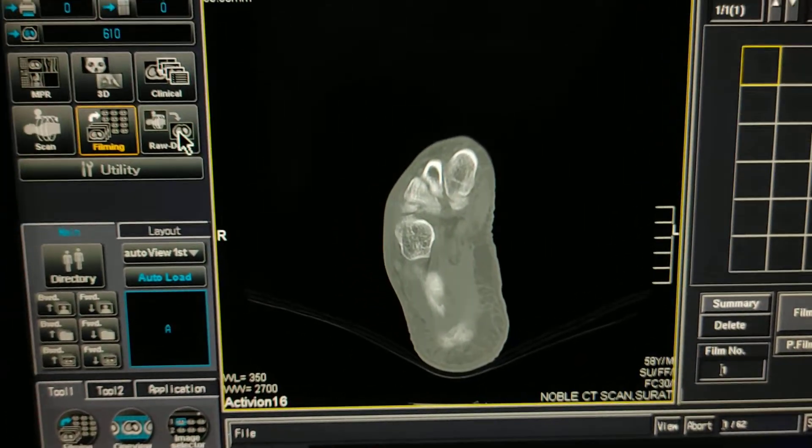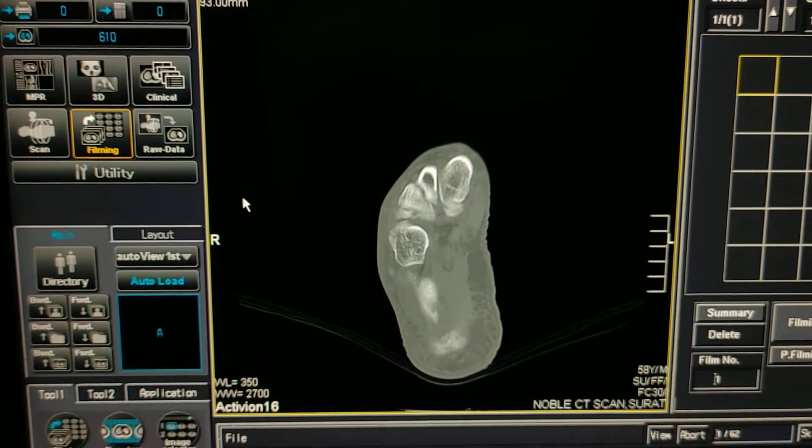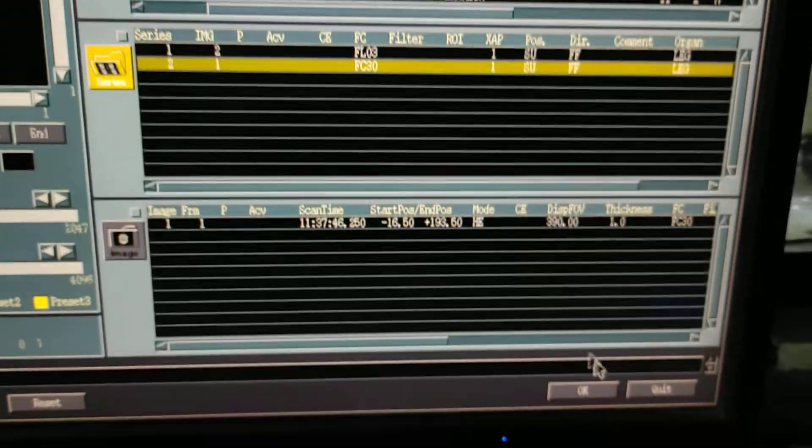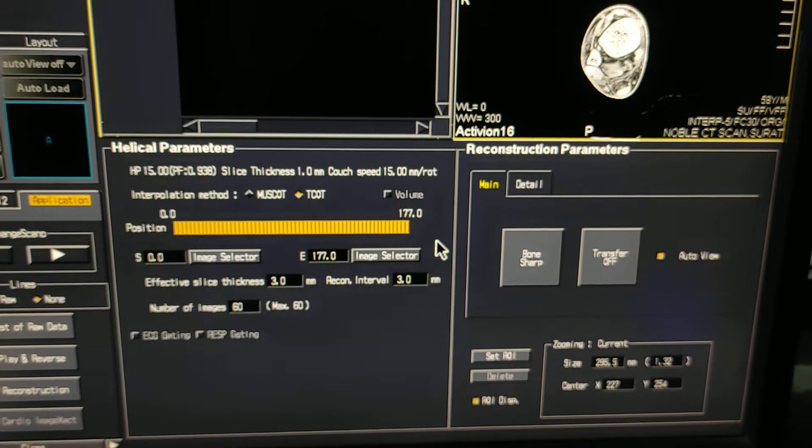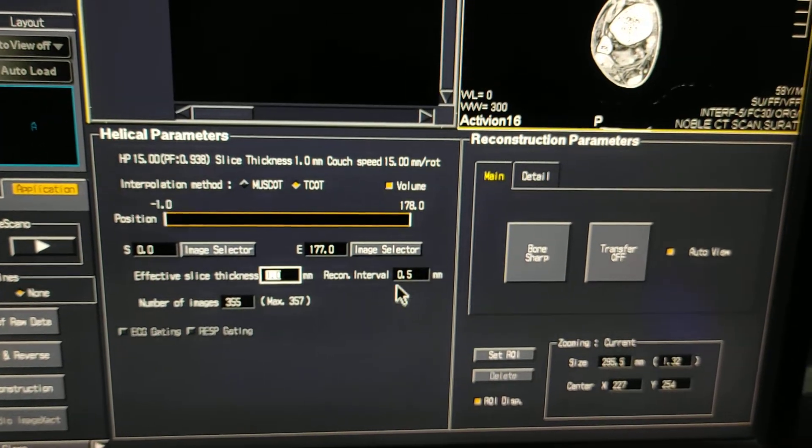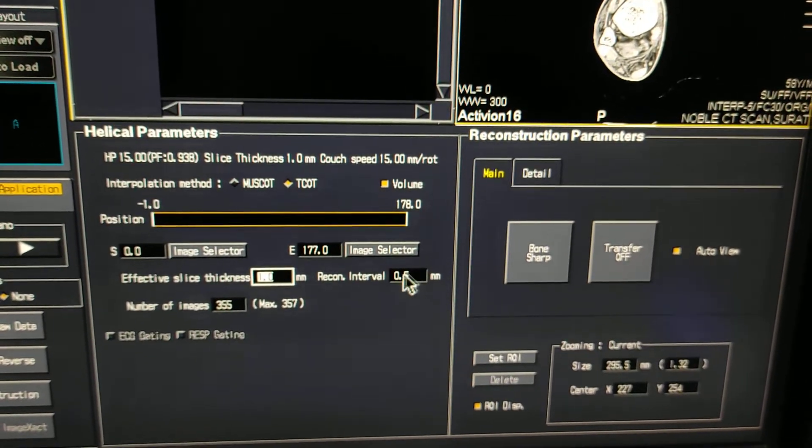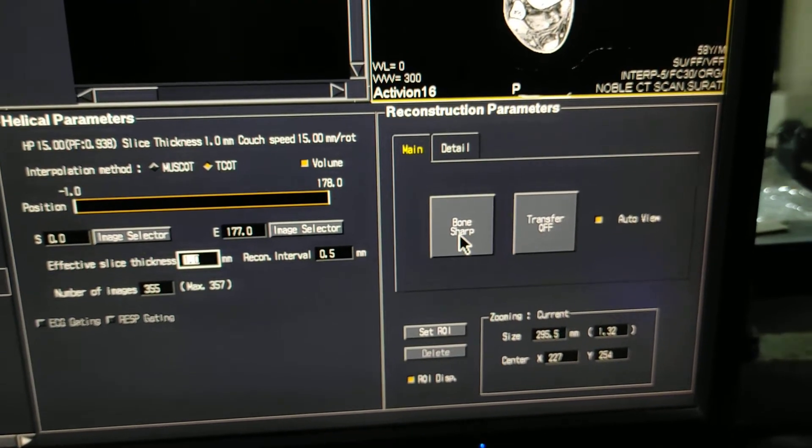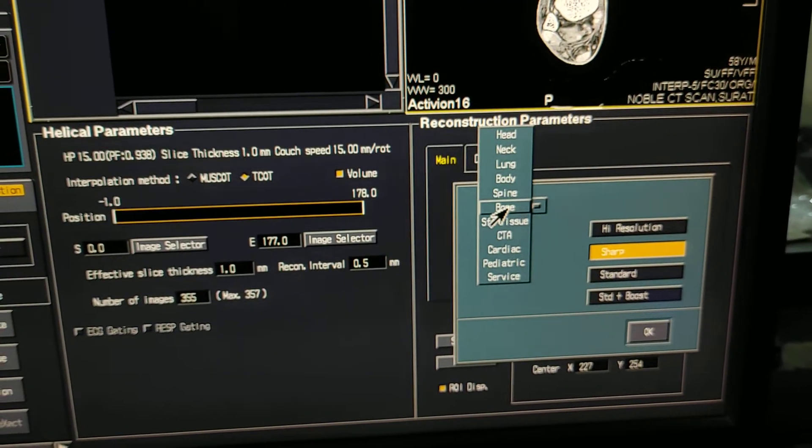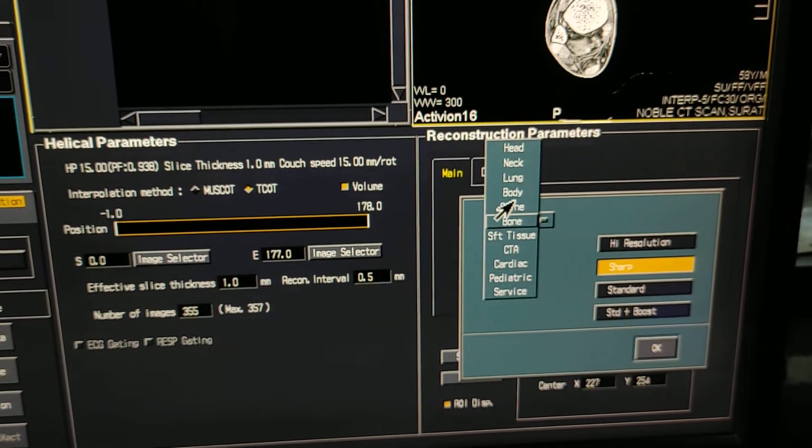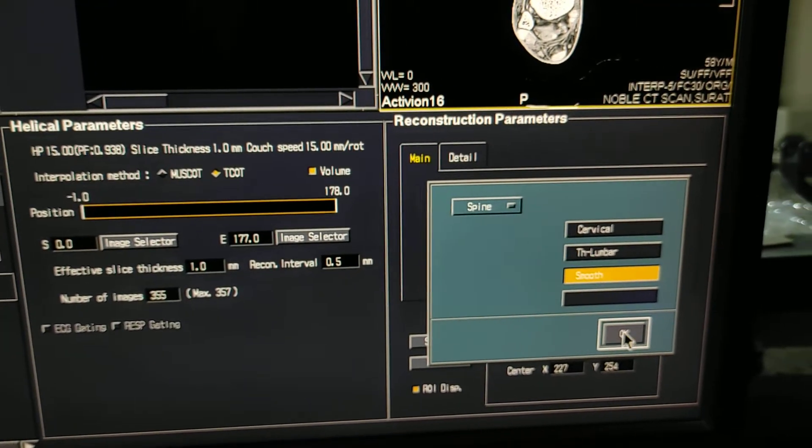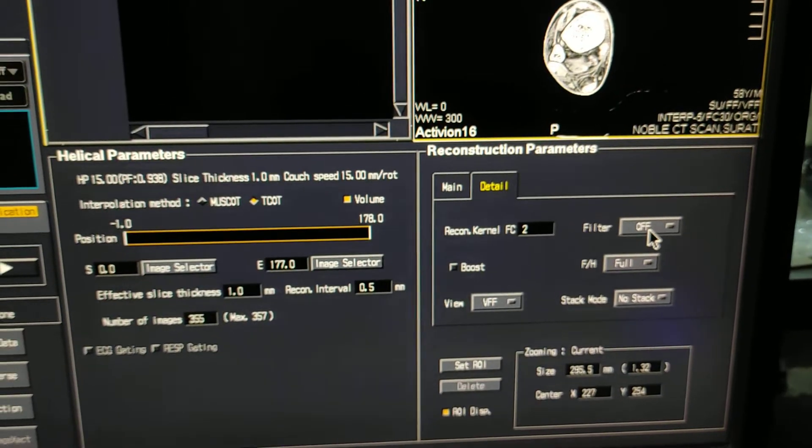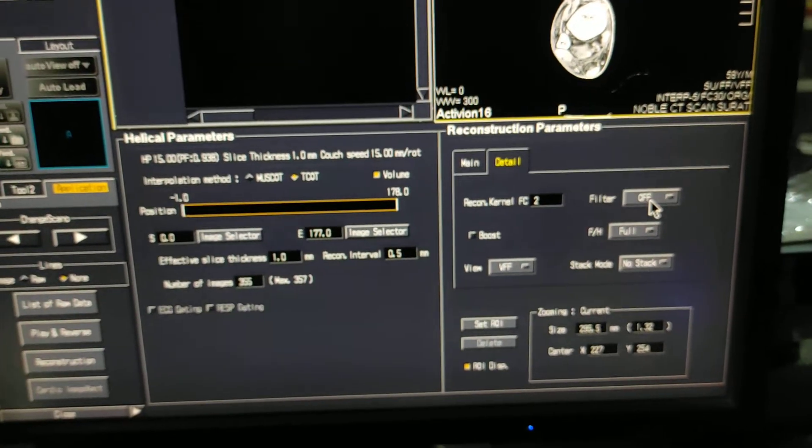Now you have to do recon. Click on raw data. Select patient series. You have to select sharp, and if you are going for 3D, you have to select. I am taking 3D in spine and smooth images. These are the FC2 and filter off. This is for 3D recon.